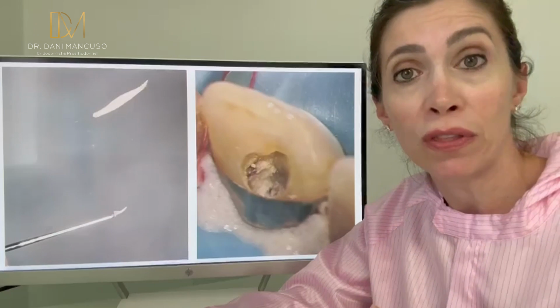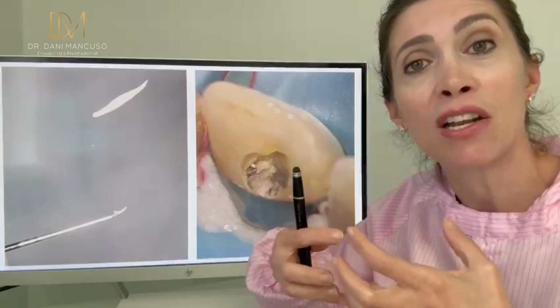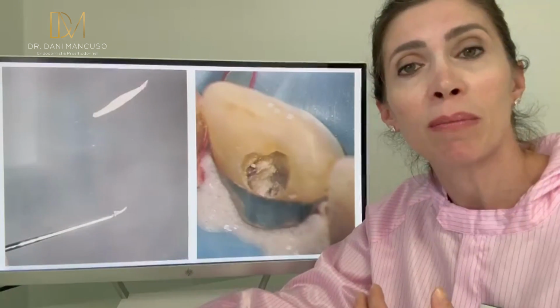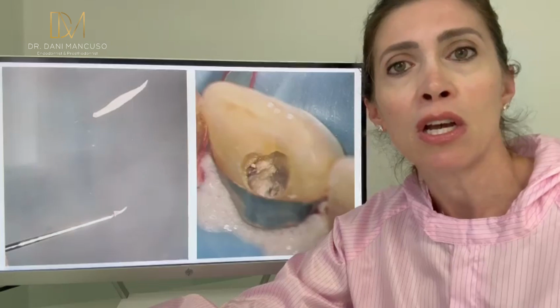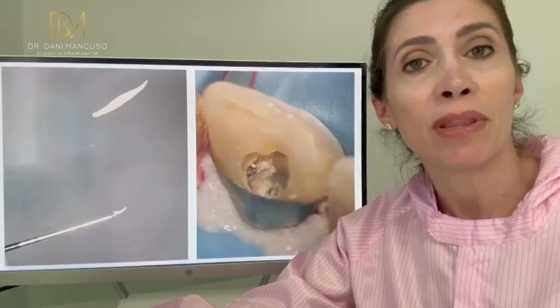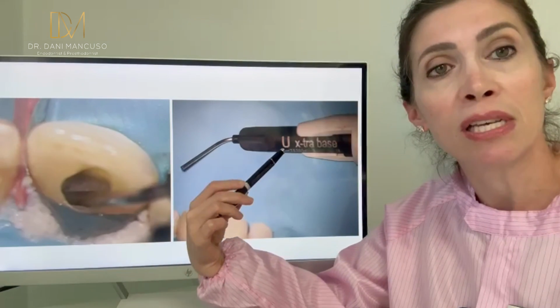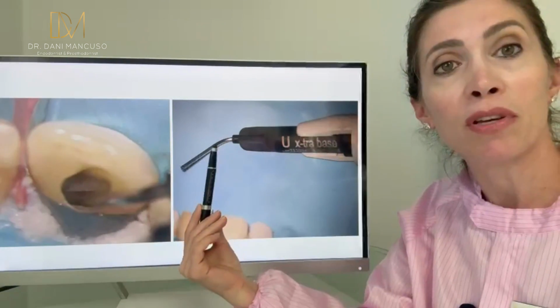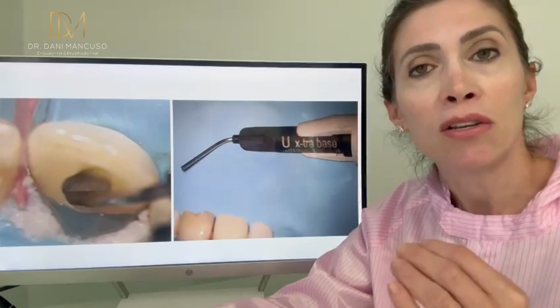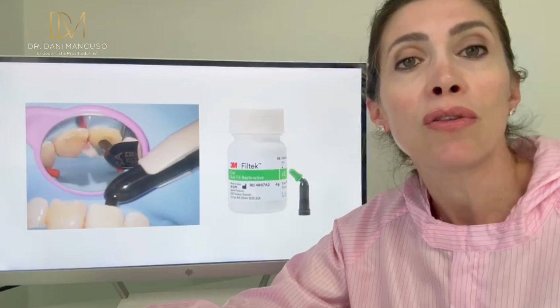Not too much, because you want the composite to bond, but in that thin layer, you may not have the matrix good enough for the composite to bond. So sometimes it's better for you to have the bioceramic putty in there rather than the composite. So you need to judge what you have as a surface. And if you are happy with that, then you can start your bond. And the composite I'm using is the extra base. I love that because it has a long tip and I can see where I'm going. I can use the DG16 just to vibrate so you don't have any bubbles in there, and you can build that tooth with a composite.